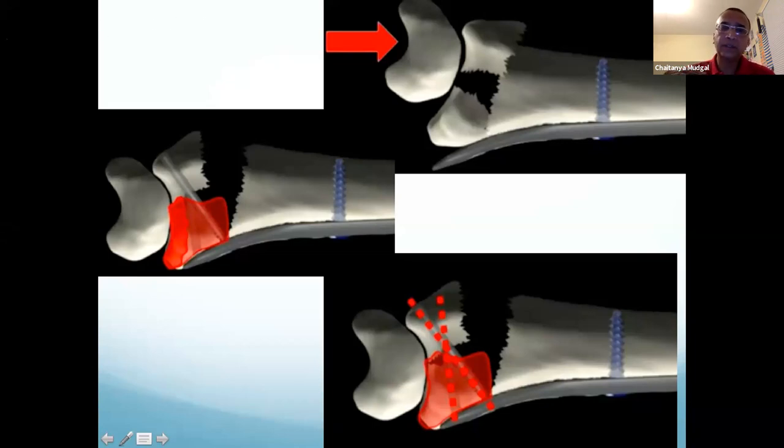The question is the dorsal fragment and its location. If the dorsal fragment is in the radial two-thirds, I don't worry about it too much if it is less than 25%. If it involves the sigmoid notch, and if it's less than 25%, I still don't worry about it. But if it involves the sigmoid notch and is more than 25 to 30% or more, then I will make sure that I include it with my volar fixation. If I'm not happy with my volar fixation, I have no hesitation in opening it dorsally. And I usually fix it with threaded K wires or with a cannulated screw with the head. And I use a washer, so it acts like a one-hole plate to get that fragment down. I rarely, if ever, need to go dorsally because I usually leave my volar pegs about 4 millimeters short of the dorsal surface anyway.